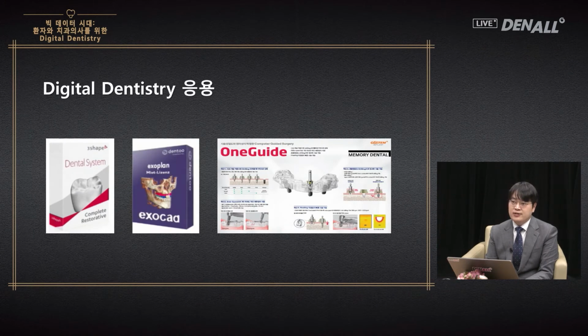Recently, crown, bridge, inlay, and guide stents can easily be fabricated using commercial CAD, and its use is getting more and more popular. Many dentists are realizing the benefits of the digital approach.